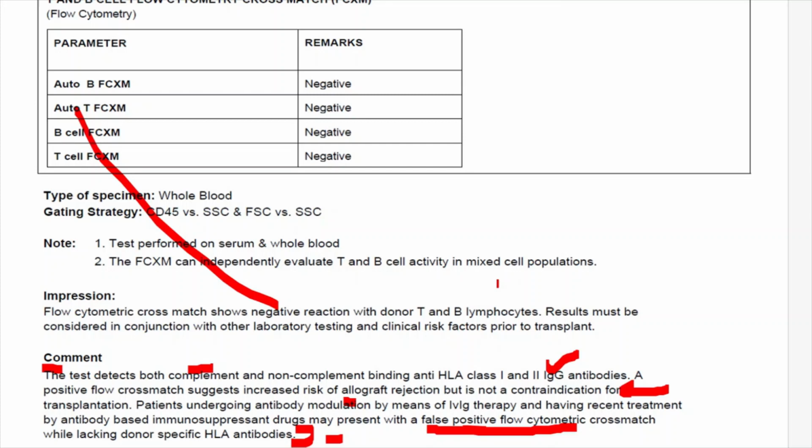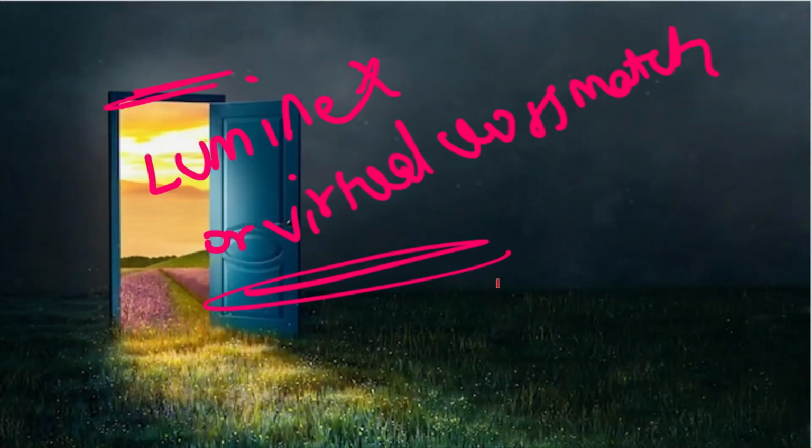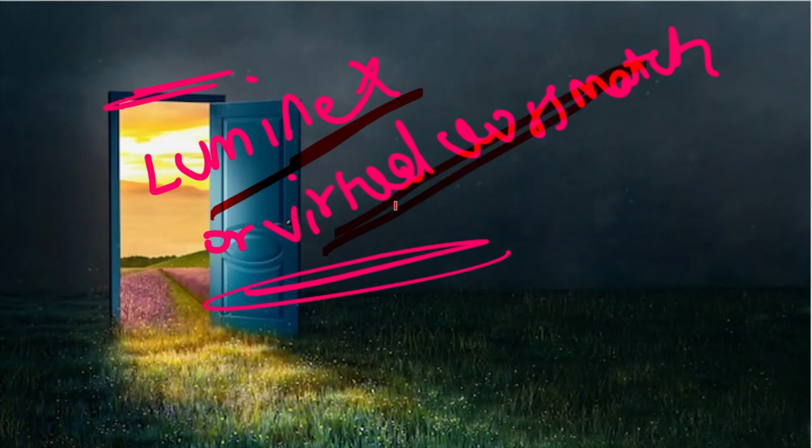for reducing the chances of rejection before the transplant. So if you give IVIG and do the test, it might come as positive. So what next? If it is positive, we have to proceed with the next one, Luminex or the virtual cross match. We have seen CDC, we have seen flow cross match. Whether it has to be done in all the patients or not: yes, CDC is compulsory.